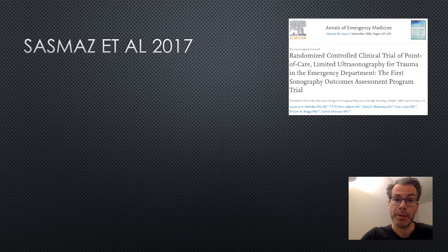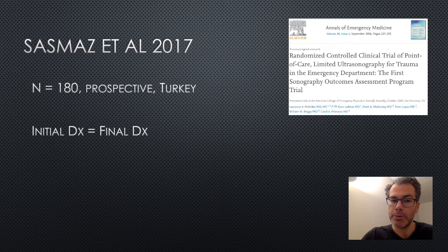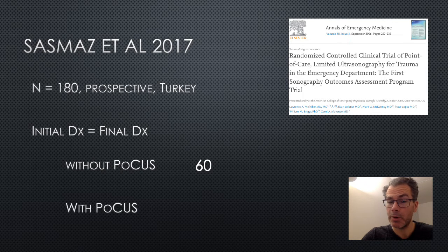A couple of years later, Sazmaz and his colleagues performed this slightly larger study looking at whether the initial diagnosis correlated with the final diagnosis with and without point-of-care ultrasound. So without PoCUS, there was a 60% correlation, and with PoCUS, an 85% correlation.